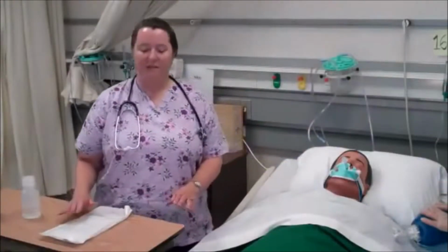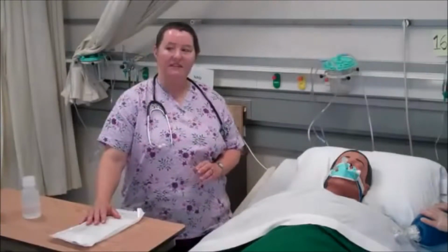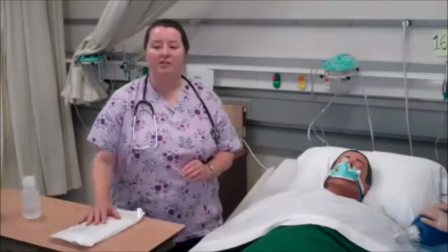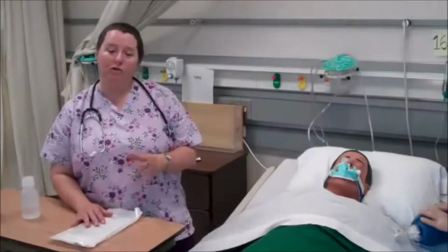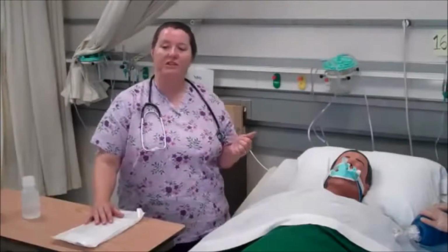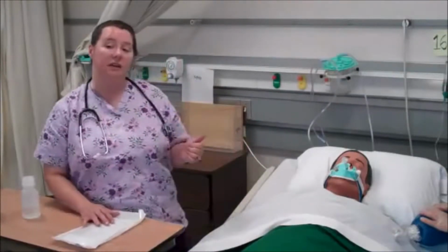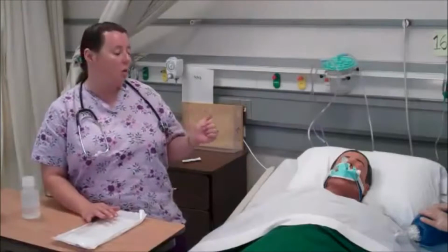We're going to be doing a demonstration right now on endotracheal suctioning. This is an invasive procedure. We need to make sure that we have a doctor's order for this procedure. Most times an endotracheal patient is in the ICU and you have standing orders available to you for intermittent suctioning if the patient's condition warrants it.